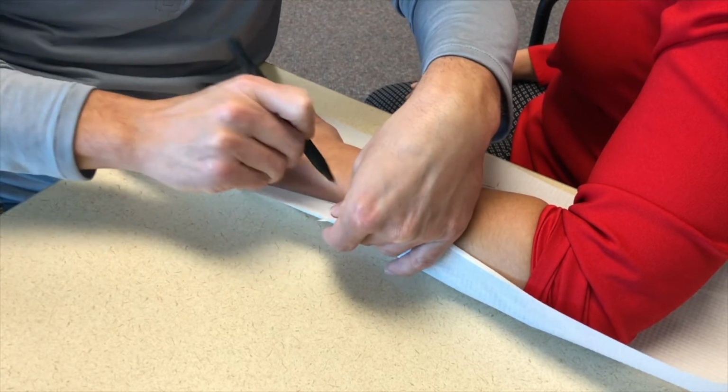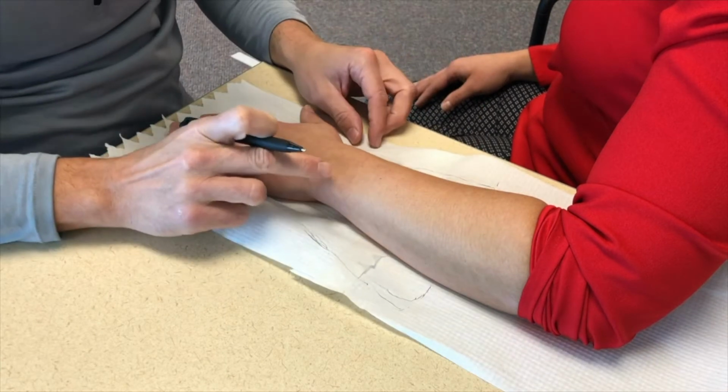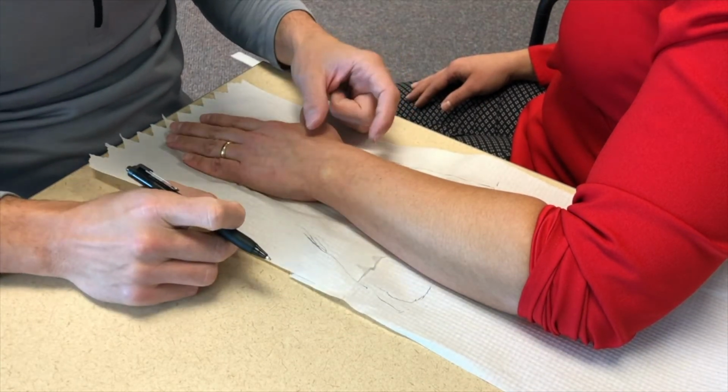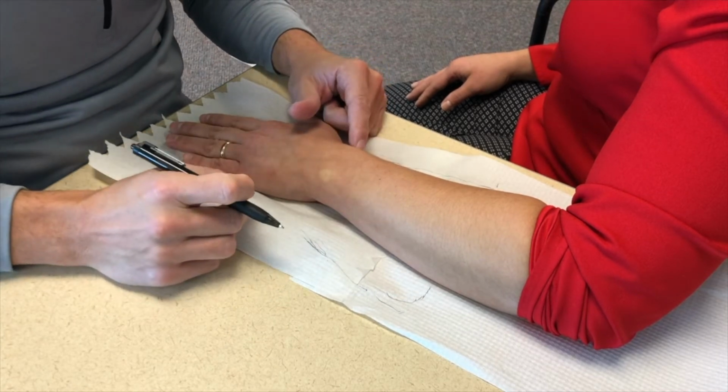As we talked about in your lectures, areas of irritation are typically the ulnar head and the radial styloid.